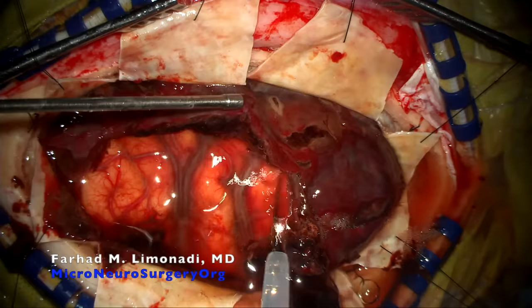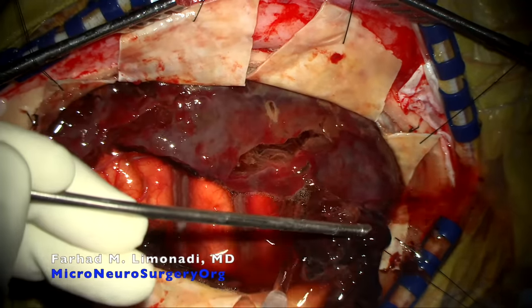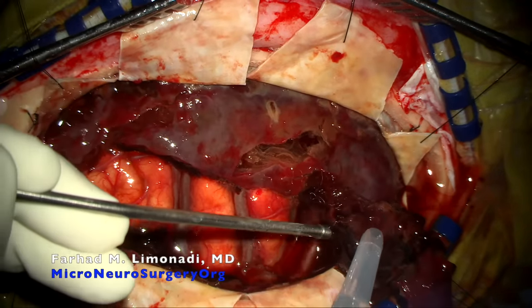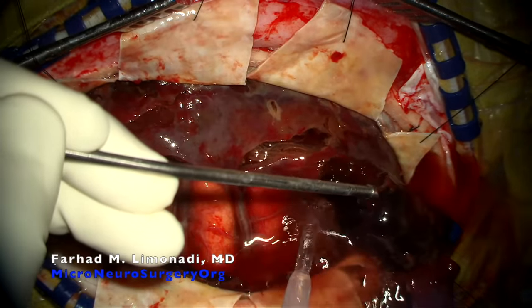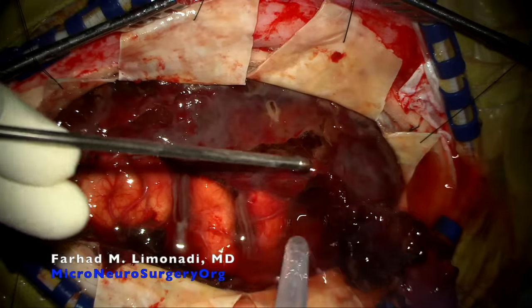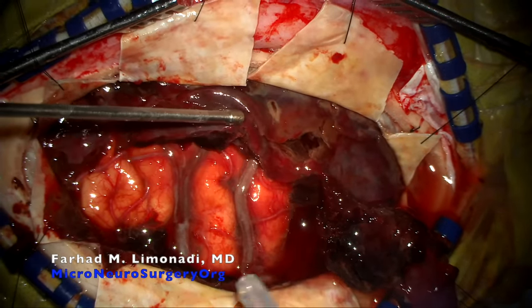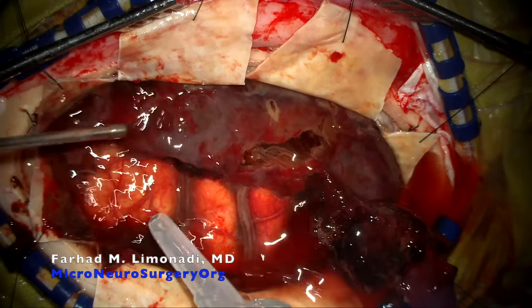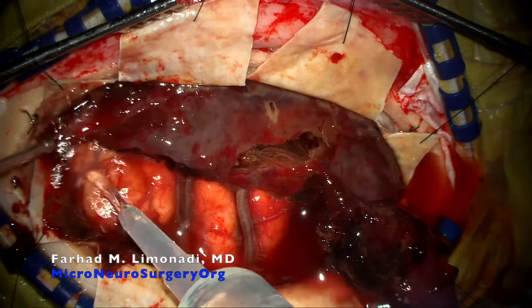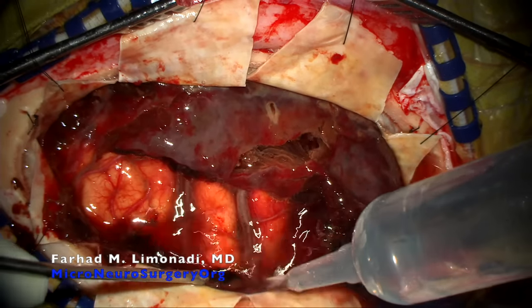While you're watching this gentle and patient process, other noteworthy points: the head is initially turned and raised slightly to improve venous drainage, resulting in brain relaxation with the surgical field flat during initial clot retrieval from the surface of the brain. Then the head of the bed is raised for clot removal from the floor of the skull. Lastly, with the brain relaxed, the head of the bed is lowered and the clot at the vertex near the superior sagittal sinus is removed.